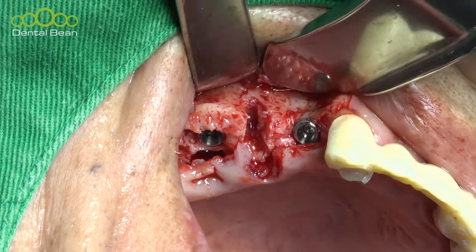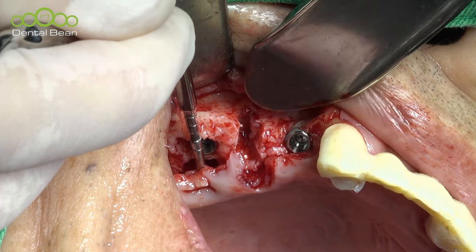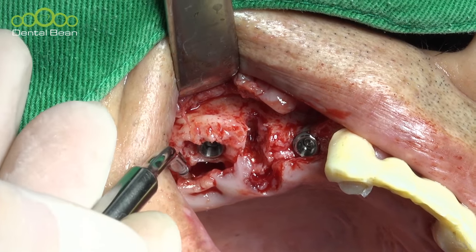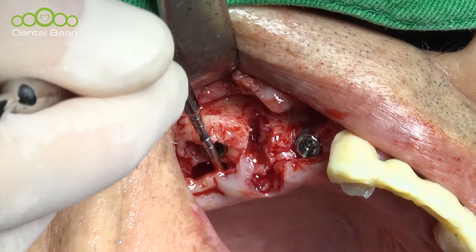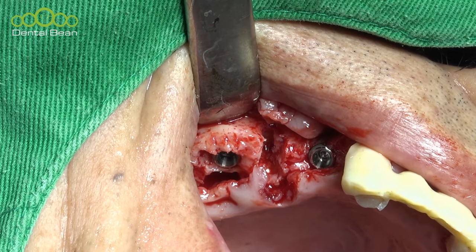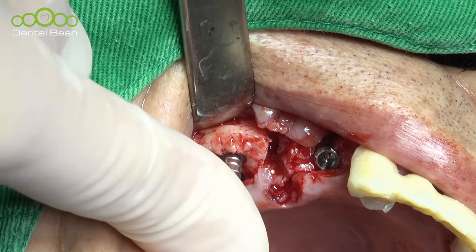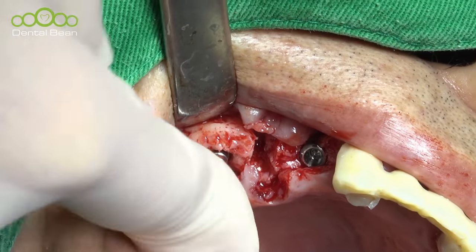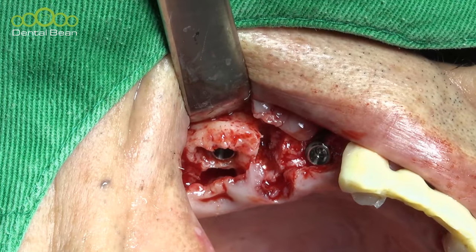Immediate placement, optimal depth control from the bone. Maybe 2mm deeper is good. So at that time the lingual margin and labial margin levels are different. So at this time, from the lingual wall, 1mm deeper is better. Healing cap.